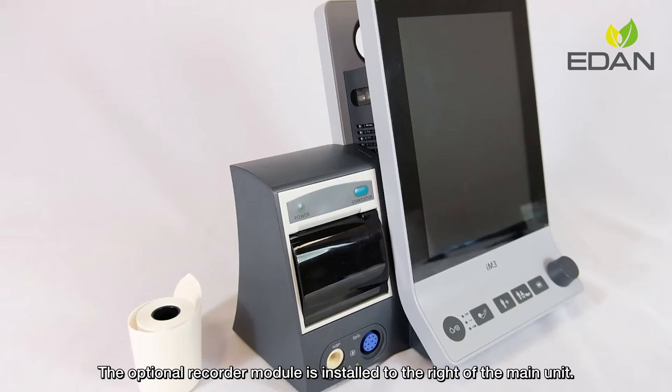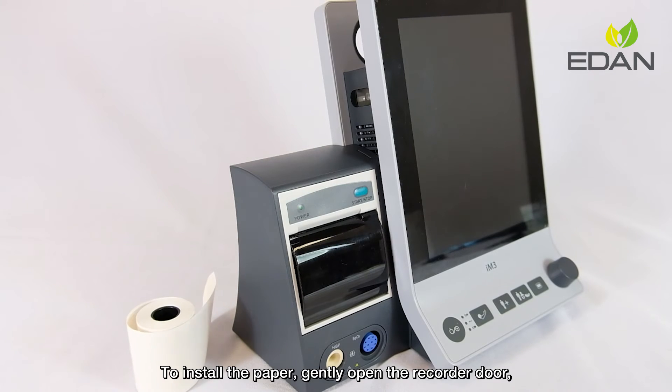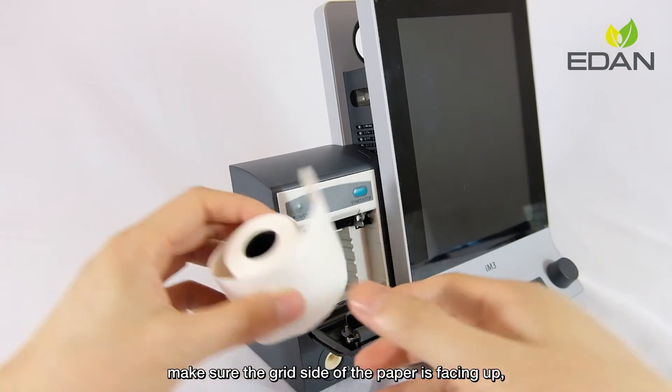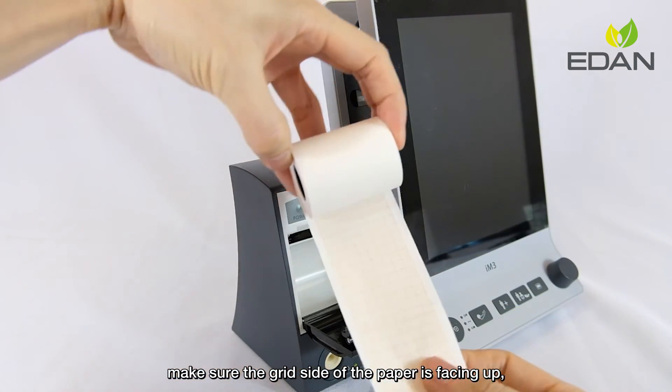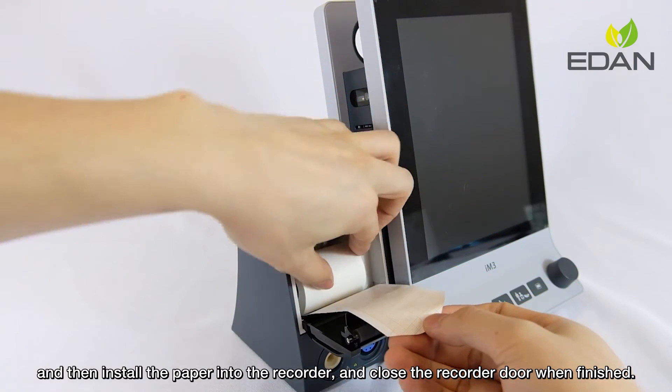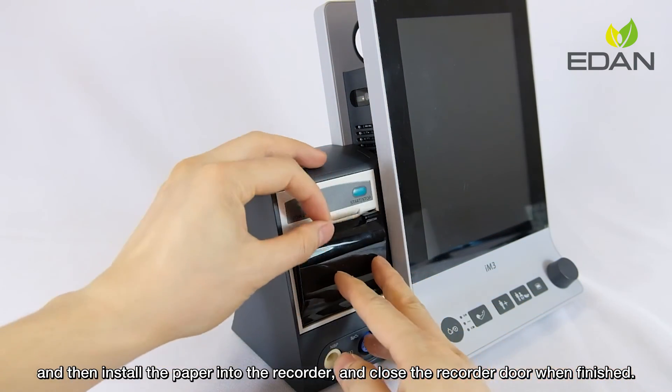The optional recorder module is installed to the left of the main unit. To install the paper, gently open the recorder door. Make sure the grid side of the paper is facing up, then install the paper into the recorder and close the recorder door when finished.